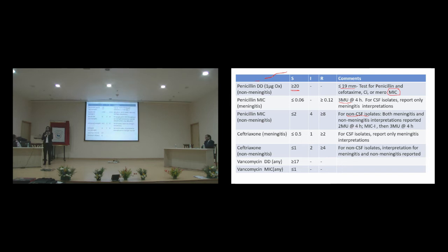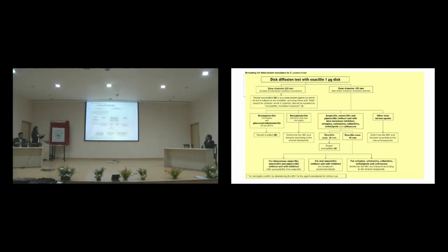If it is more than or equal to 20, you report it as sensitive to penicillin, ceftriaxone, cefotaxime and meropenem. If it is less than or equal to 19, you have to do MIC test for the individual antibiotic and report as per the breakpoints. Clear now? Okay. So I'll skip this table because you may get confused with this.